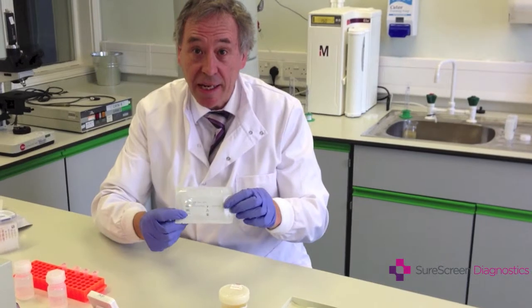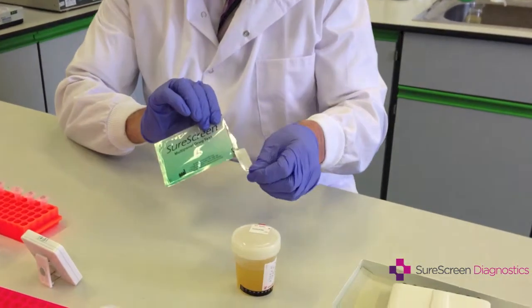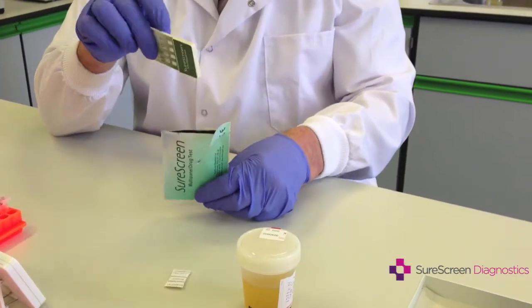Make sure that the test is in date and is sealed. Open the packet and take out the card.